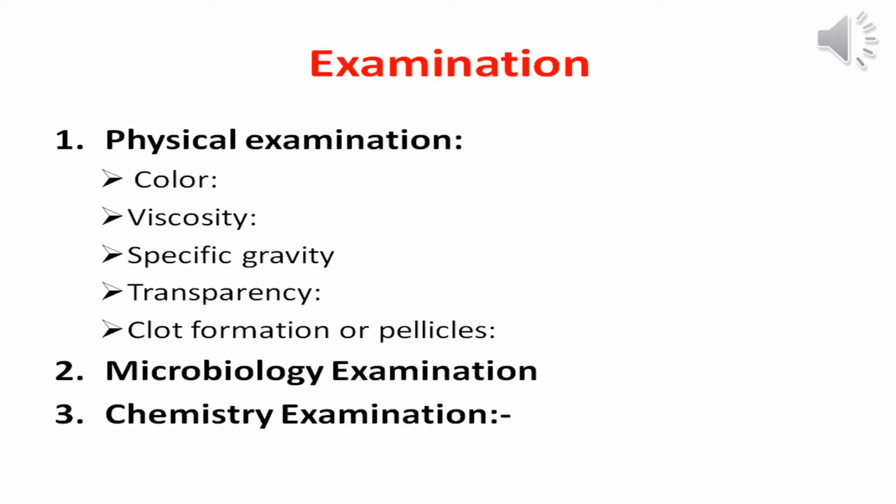For the microbiological examination, the most important thing is to culture the sample on the primary plates. The primary plates used to culture the CSF sample are blood agar media, chocolate agar media, and MacConkey agar media. Remember that the chocolate agar plate should be incubated under CO2, at a temperature of 35 or 37 under CO2 conditions.